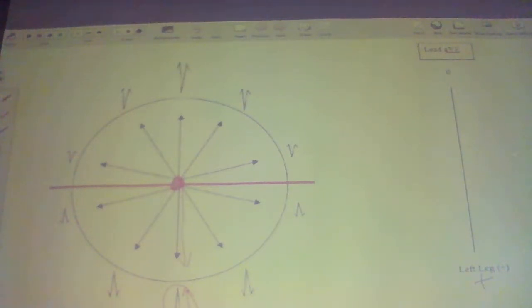And the reason for that is because the depolarization vector is heading directly in the direction of that positive lead of aVF. So if the depolarization happens in this fashion or in this fashion, we'll also get a positive QRS because in fact, all of this is positive territory. No matter where you're heading here, this is all positive territory because it's to the bottom of this separator, which is the big red line here, that separates positive and negative. So negative is up here and positive is down below. So anytime depolarization heads in the direction of positive, you're going to get a positive deflection on the EKG.